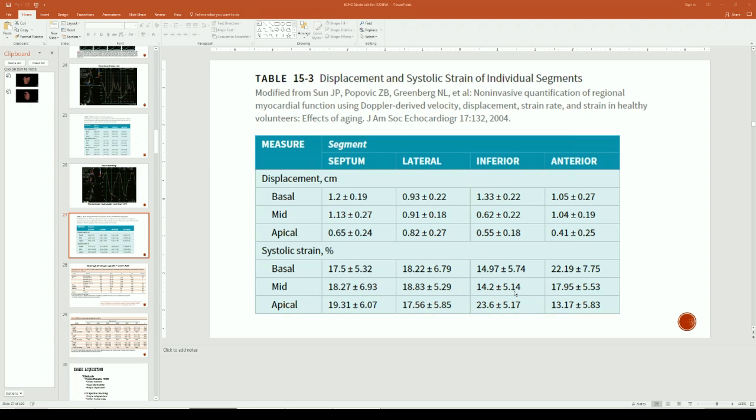So just looking at one value doesn't tell the whole picture, looking at 3D structure. A question from looking at this is, with global longitudinal strain, should each segment be weighted differently? Right now we're just taking all these longitudinal values and averaging them together. Should longitudinal strain on one wall segment that contributes more be weighted differently from a segment where it's less important? Is that a better estimate of global longitudinal strain as opposed to weighting them all equally? I don't know if that's been looked at or considered.